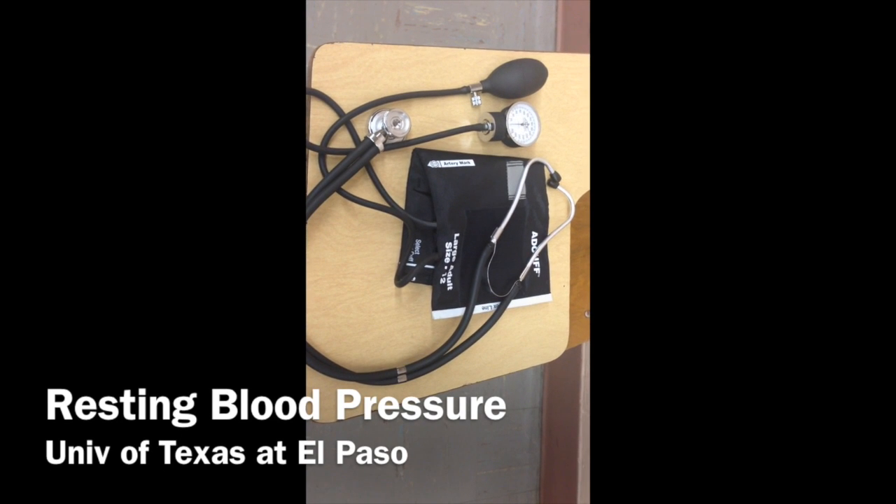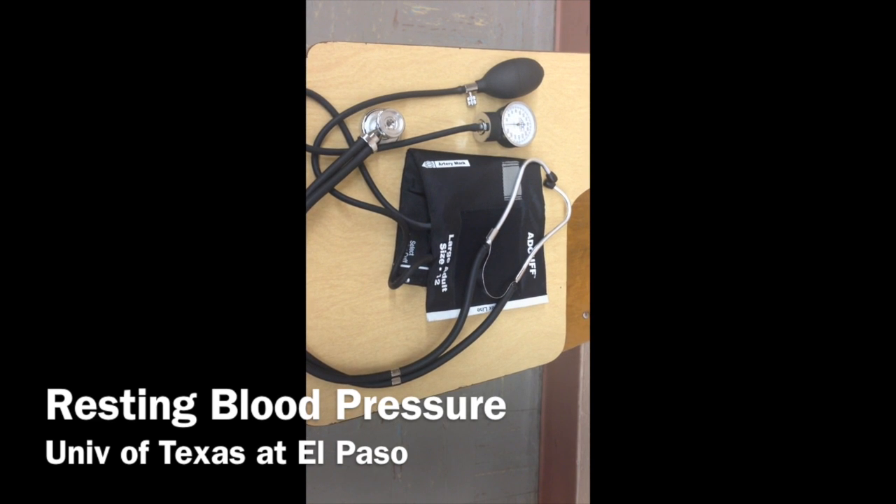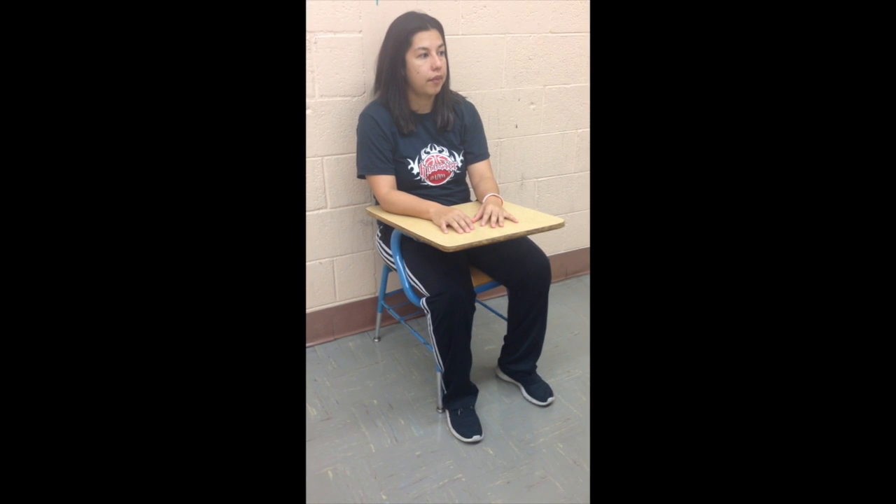Today we will be learning how to take resting blood pressure. An important thing to remember is that the patient should refrain from smoking cigarettes or ingesting caffeine at least 30 minutes prior to the measurement.